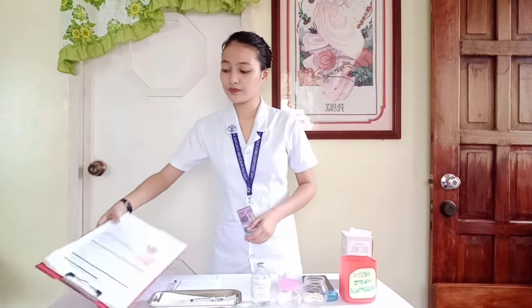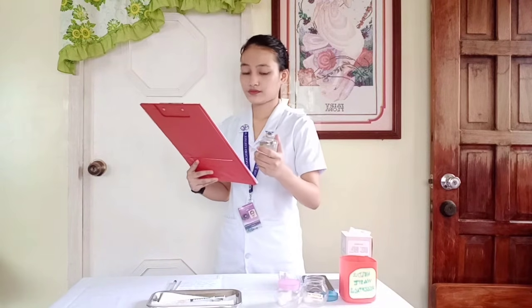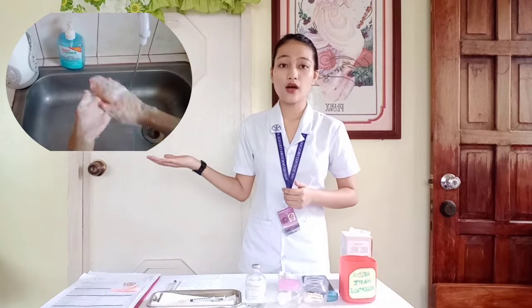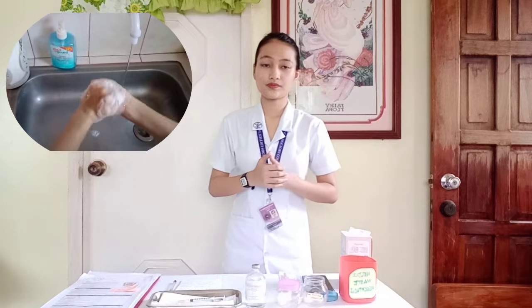First, we'll have to read the doctor's order and compare the medication on hand. It is the same. Then perform hand hygiene to avoid infection and cross-contamination. After that, we'll also have to prepare the medication and the equipment needed for a subcutaneous injection.